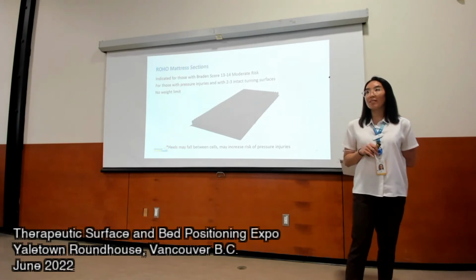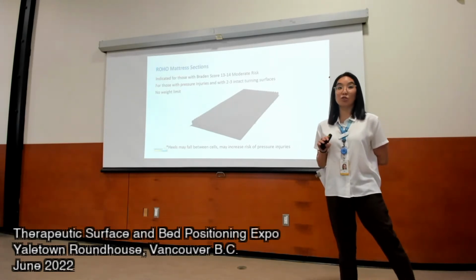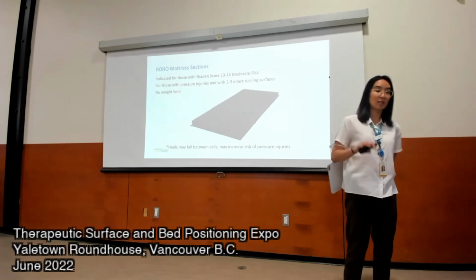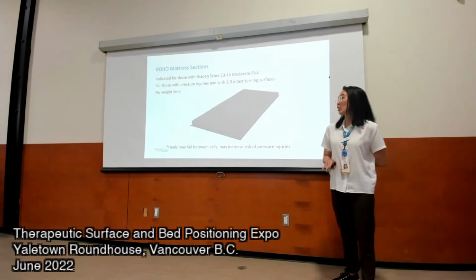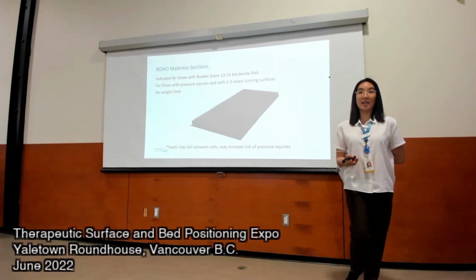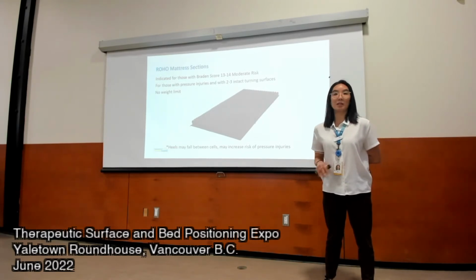We do recommend that inflation be checked 2 times a day, okay? Usually morning and evening. I know that doesn't sound super realistic, but it should be checked 2 times a day to make sure that there's no slow leak throughout the course of the day, and then full-on recalibration quarterly, every 3-4 months or so.